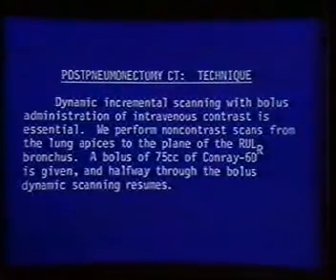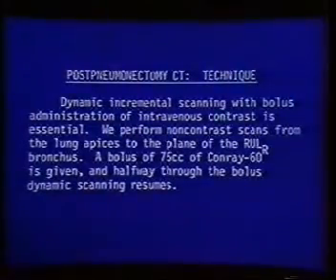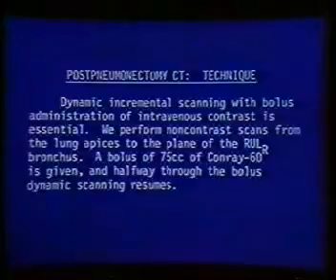Now, I should point out that if you're going to do post-pneumonectomy CT, technique becomes very important. I think you really need dynamic incremental scanning with good bolus intravenous administration of contrast, because you really need to be able to sort out the normal vessels centrally from the adjacent soft tissue that might represent recurrent tumor.